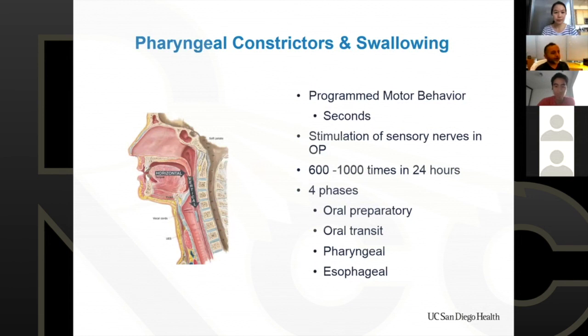I think across institutions, there's still a lot of variability of whether you draw the entire parotid gland or whether you just draw the superficial lobe of the gland. And even here at UCSD, about 4 or 5 years ago, we had to standardize the way we all drew the gland, because there was a lot of heterogeneity across all of our sites as to what people did and how people evaluated a plan. So right now, the way we evaluate a plan, we look at the entire parotid gland, basically, both contouring the deep and superficial lobes. Okay, thank you so much.